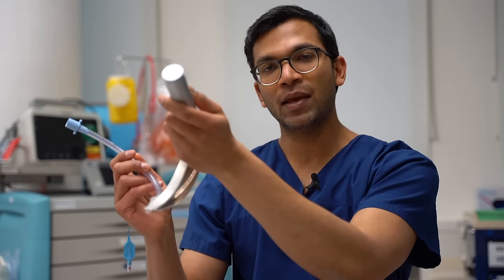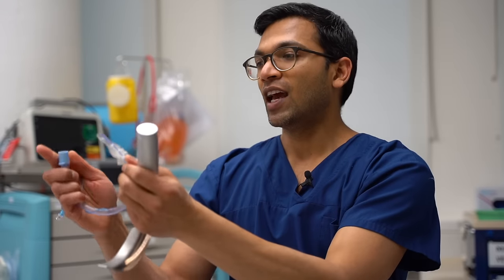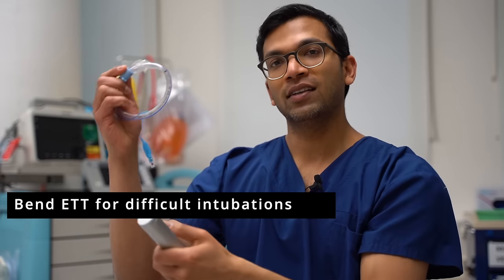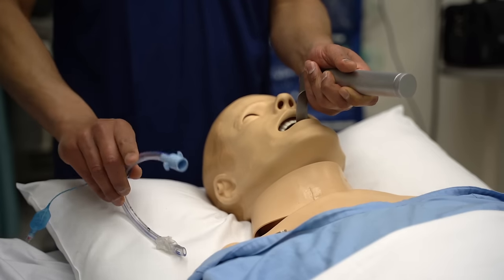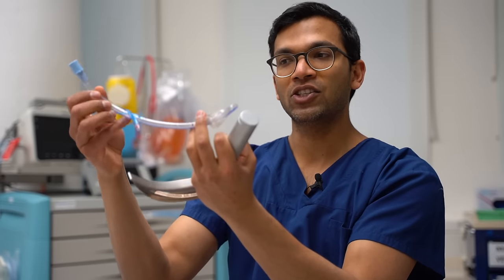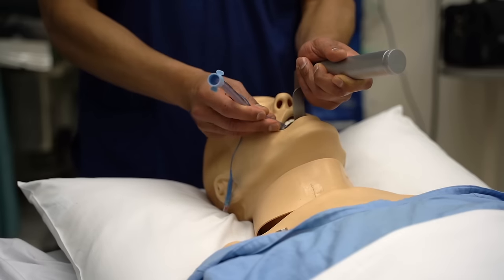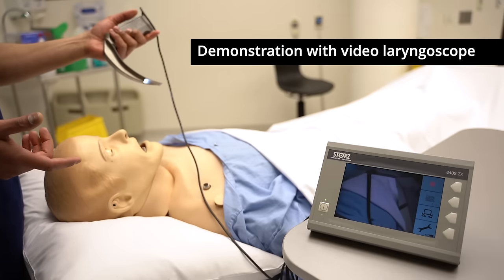Sometimes you just can't get the angle — the larynx may be anterior. A couple of simple things you can do: have your tube already bent preset, or bend the tube on the pillow and as it slowly recovers its shape, place it through the cords.